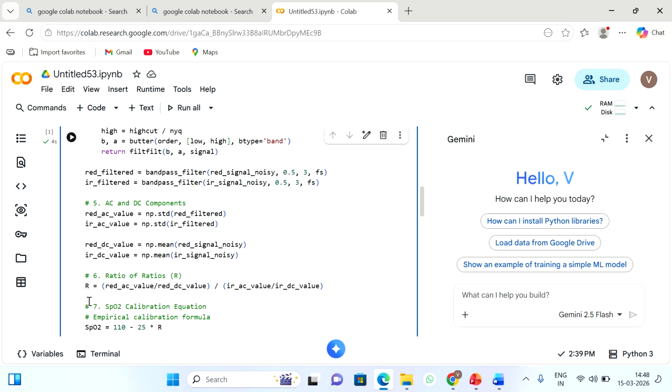And then the DC component. red_DC_value is equal to np.mean of red_signal_noisy. In the same way, IR_DC_value is equal to np.mean of IR_signal_noisy. The mean value, as we normally know, is the baseline level. So it represents the DC value. And then the ratio of ratios: red AC component divided by red DC component, whole divided by IR AC component divided by IR DC component.